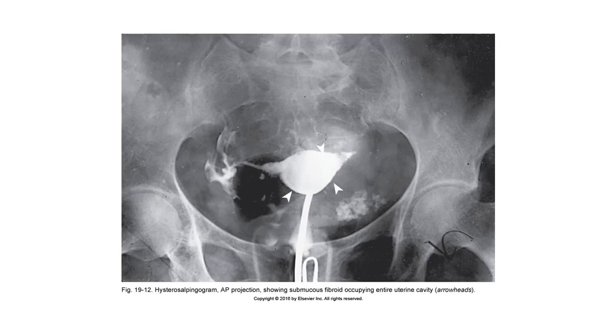Before the procedure, the patient should empty their bladder, irrigate the vagina, and clean the perineal region as instructed, with supplies provided by the radiologic technologist. A preliminary scout image is made, then the patient is placed into the lithotomy position. The physician places a speculum into the vagina, and the uterine cannula is placed into the cervix. Contrast is injected under fluoro to fill the uterus, and should spill into the peritoneal cavity if the tubes are patent.